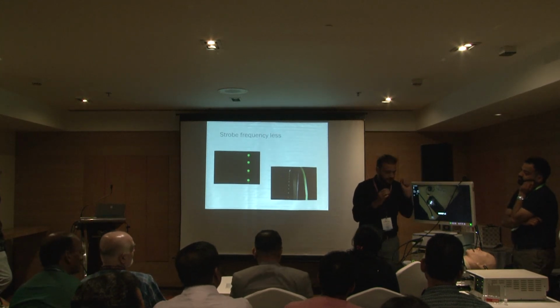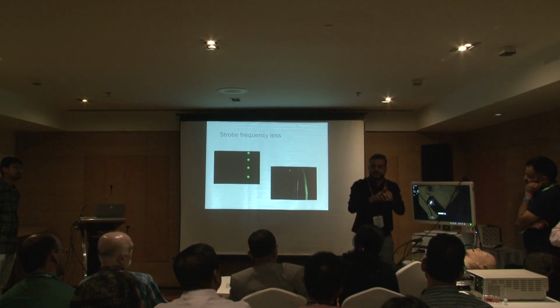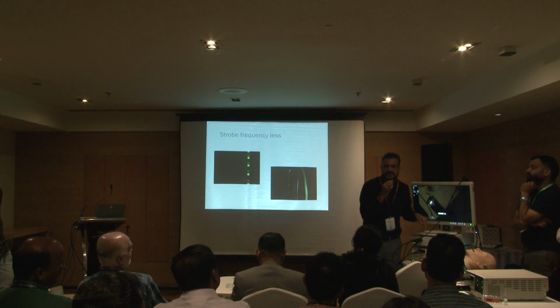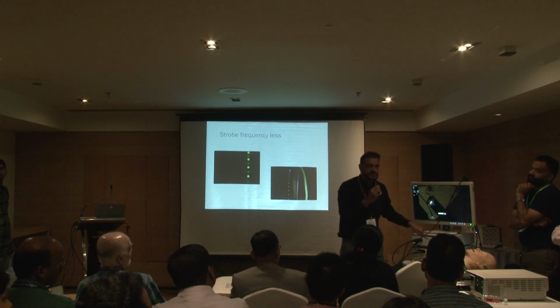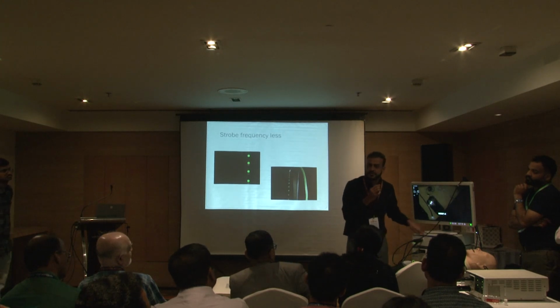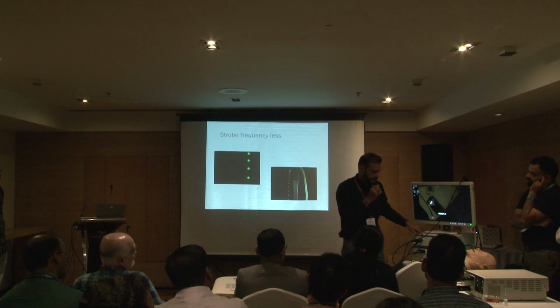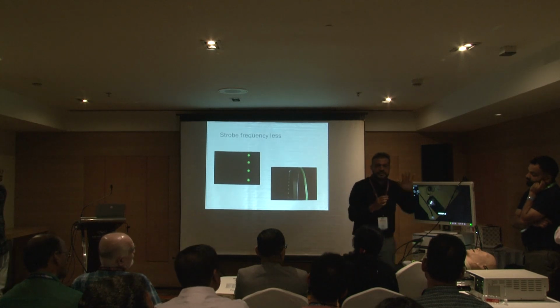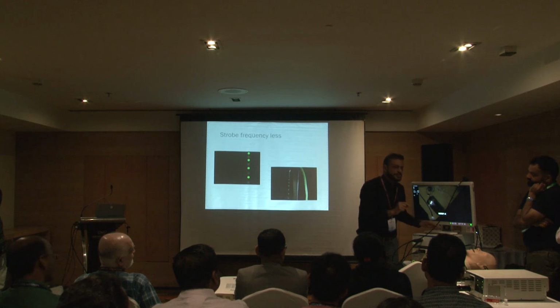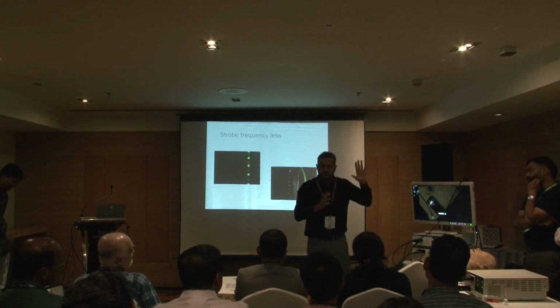Easy to remember. So first of all, you need to understand how fast the vocal cord is vibrating. Who will decide? Machine will decide. So the moment my voice is being recorded here, it shows. If I am saying it goes to 400, so you see the frequency of the vibration is increasing. If I am saying it lower, it is coming down. So the lower the pitch of the sound, the lesser the frequency of vibration. This is F0. So the first point that we note in case of a stroboscopy is noting down the F0 of the patient. That is noted.